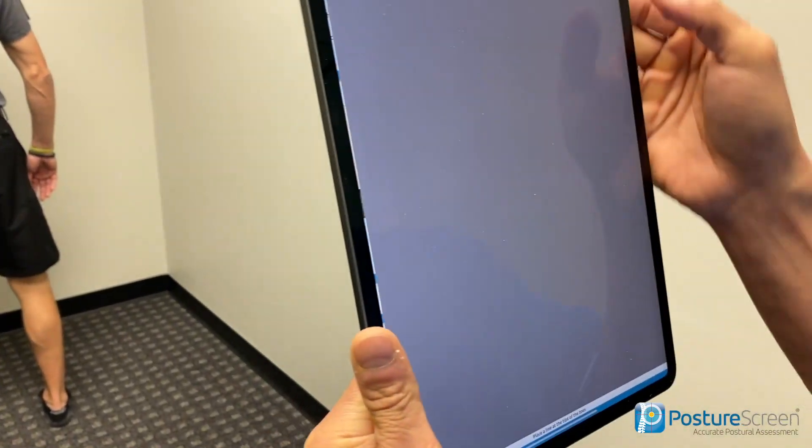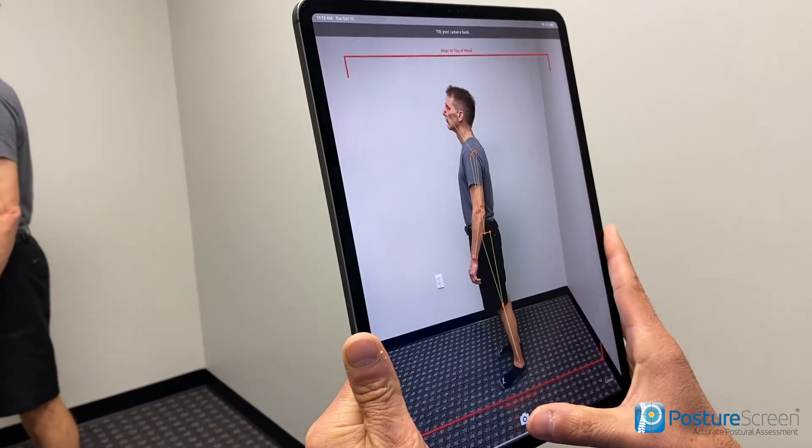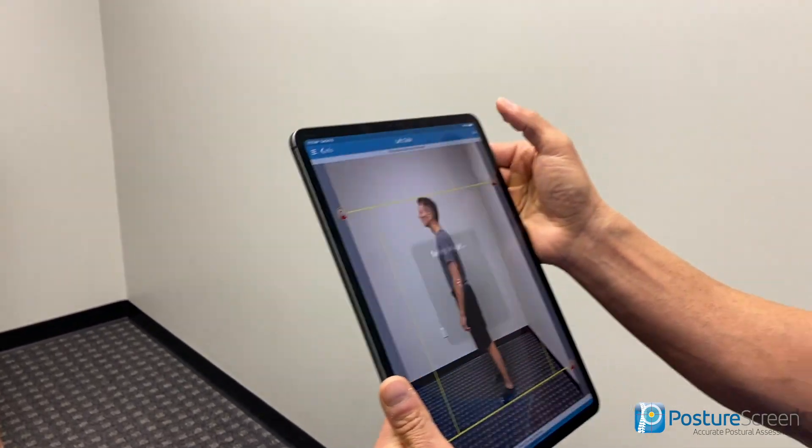We're going to scale this and then he'll do another quarter turn. I have the advanced features turned on for the four-view — you can turn those on or off. The advanced features include thoracic kyphosis, ASIS and PSIS angulation, ankle pronation/supination, and Q angles, which are also calculated. If you don't have those measurements showing in your four-view, we have a video on how to turn those features on — they're off by default, but I've turned them on here.